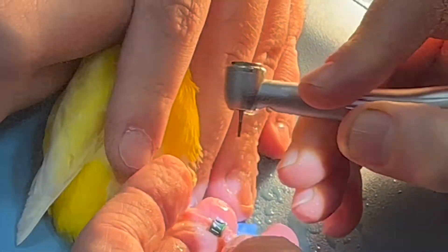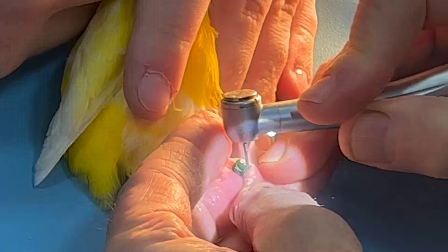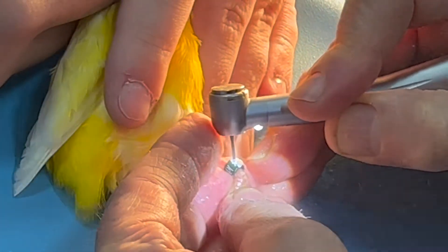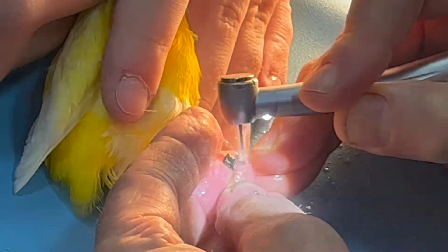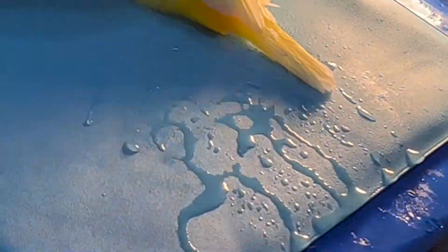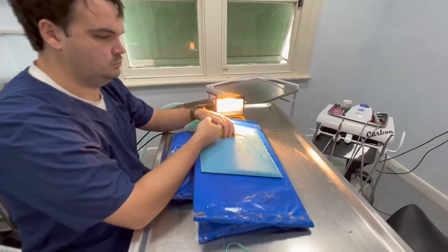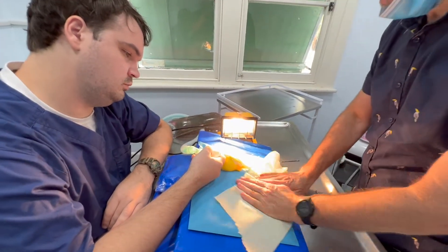Okay, let's go — switch it off. So as you saw, it comes off relatively easily. Ethan was really good; he actually protected the bird from all the water because it's a high-speed drill so it gets hot.